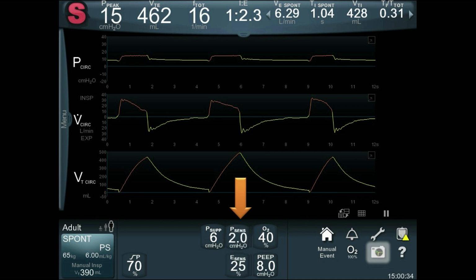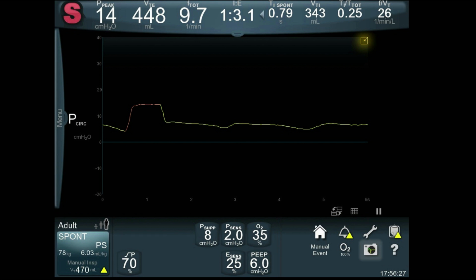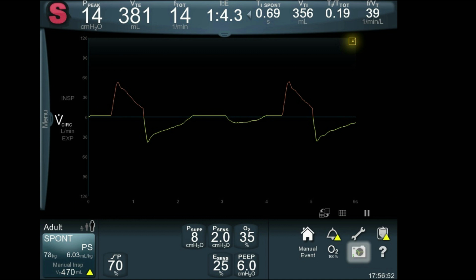This is what pressure triggering looks like on this particular column. And this is what Sync looks like. Let's go back to this patient. This is the scenario of Chris, who developed COVID pneumonitis and ARDS and is now trached and recovering slowly. Unfortunately, we have failure to trigger the ventilator, and this is a major problem. We've already tried and failed with flow-by, and as you can see, we are currently failing with pressure triggering. This is his flow waveform.